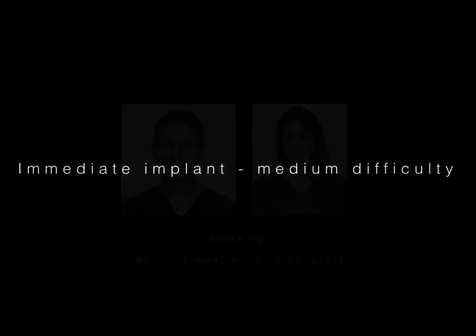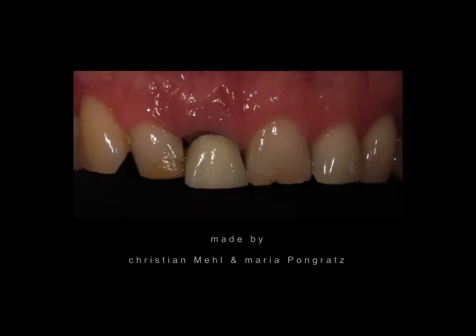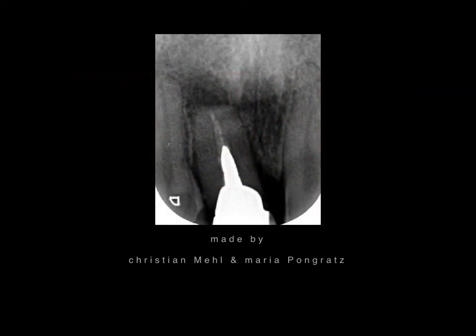And in this case, I would like to present you an implant which is not that easy to place and not that easy to restore, as we have inflammation. Here's the initial situation: a tooth 25 years in position with inflammation distal of the tooth and an apical infection.